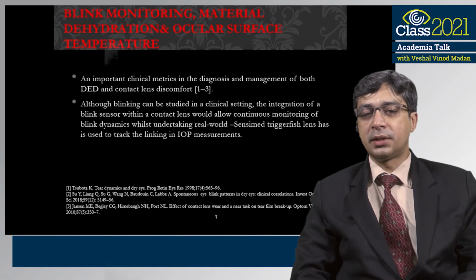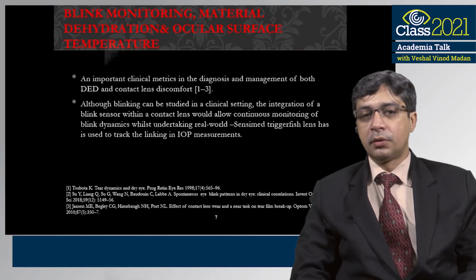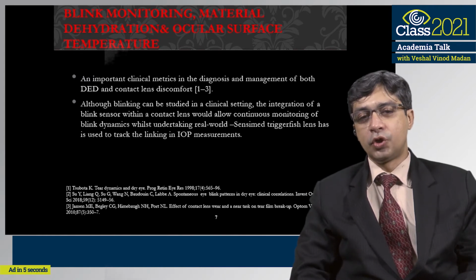As far as contact lenses are concerned, there are further enhancements which can be used. Not only can they measure, monitor, and aid in diagnosing the inflammatory markers, but they can also be used to monitor the blink of a person if blinking is the culprit. So lenses like Triggerfish can be modified for monitoring as well as aiding in correction of the blink rate for people who have a reduced blink rate, as is very commonly seen in people who are in front of monitors and other visual devices.